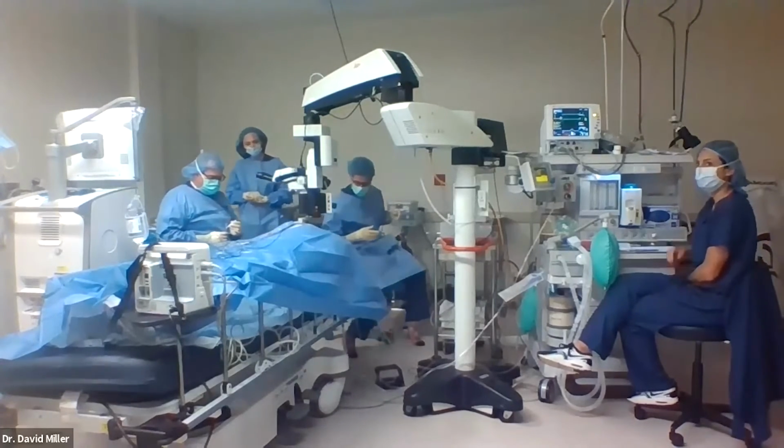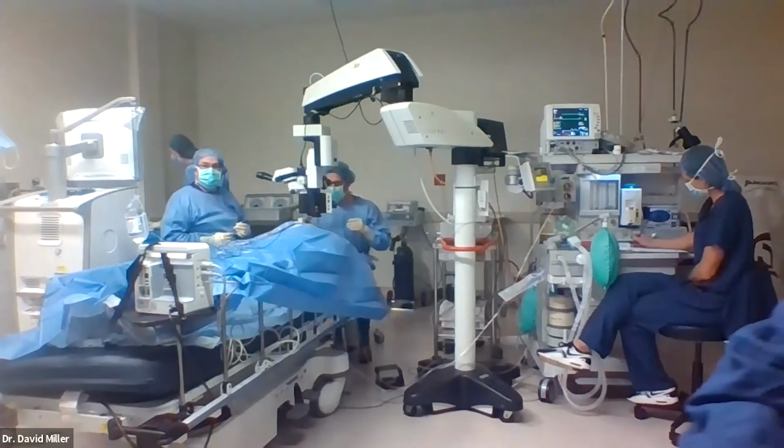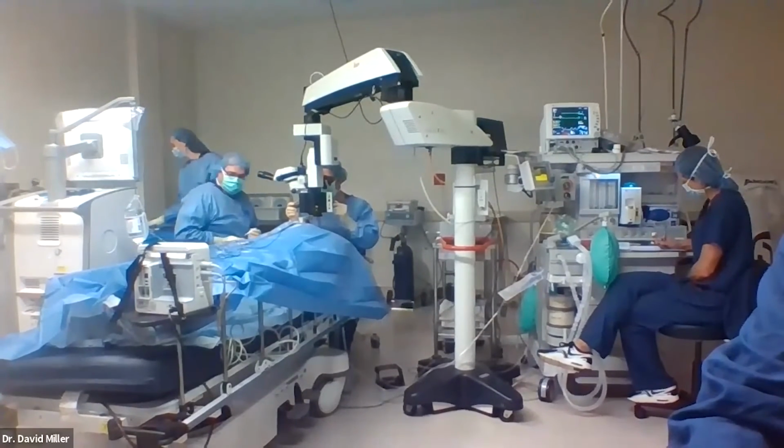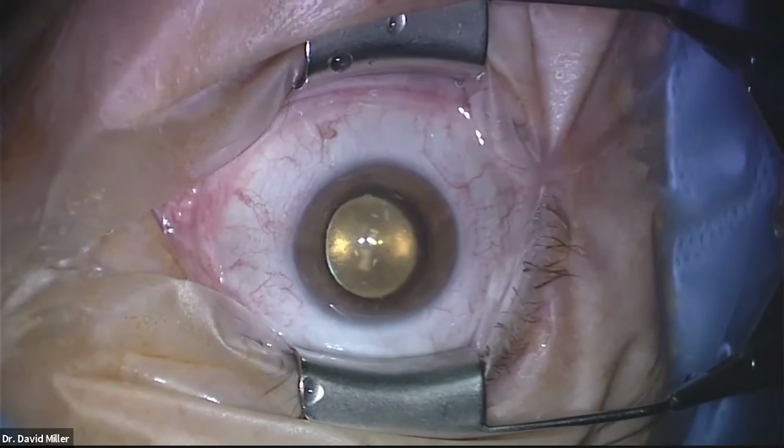So Mike has the patient again expertly draped and eyelashes out of the way, and the table's a little lower this time. Thank you. And there is our eyeball there. This is a right eye. Very good.